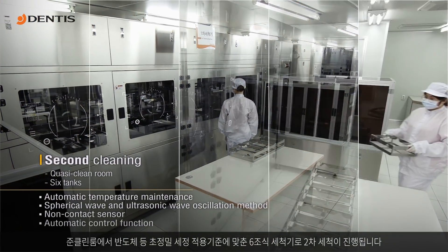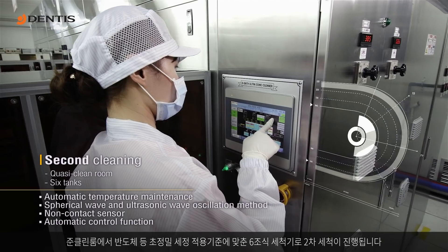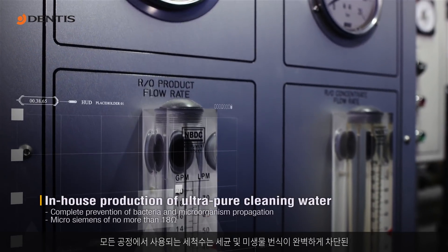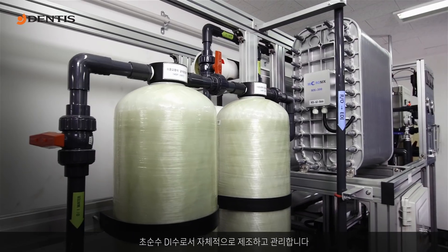In a quasi-clean room, the implants undergo ultra-precise cleaning in six tanks, as is done for such products as semiconductors. The DI water used at this stage is ultra-pure, 100% free of bacteria and microorganisms, and is produced in-house.